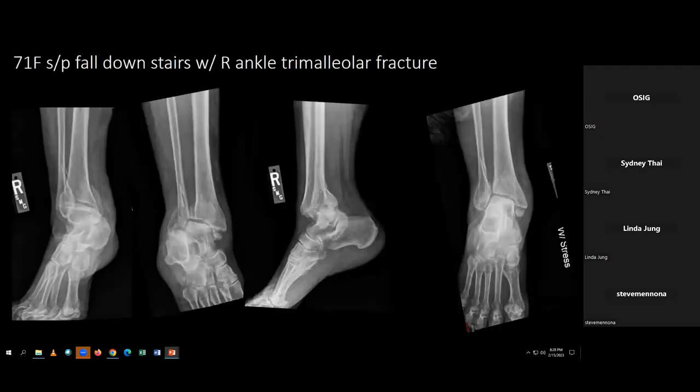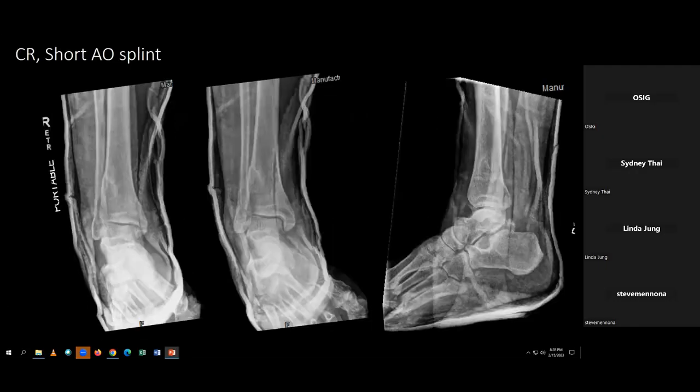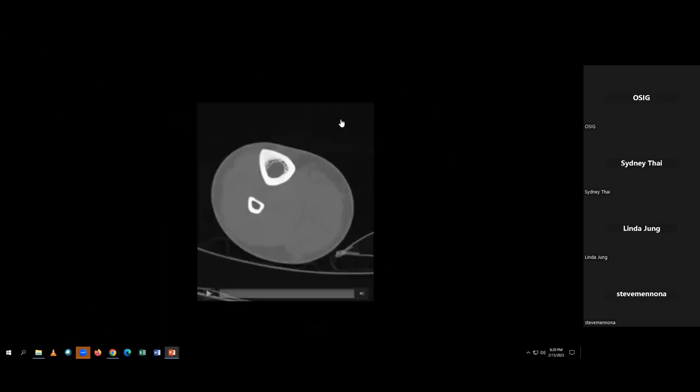Just explain what that diagnostic modality is. Oh, that's right. Yeah, so that's a CAT scan. X-rays alone give you a static view of the picture in time, but the CAT scan will let you, and usually there's other views. I'm sorry, I only included the one view here, but usually this is an axial view. So it's like you're taking a cross section, you're chopping your leg straight down the middle. And then there's also a sagittal view, which is the side, and then the coronal, which is the straight on front. So usually that's what a CAT scan will show you.